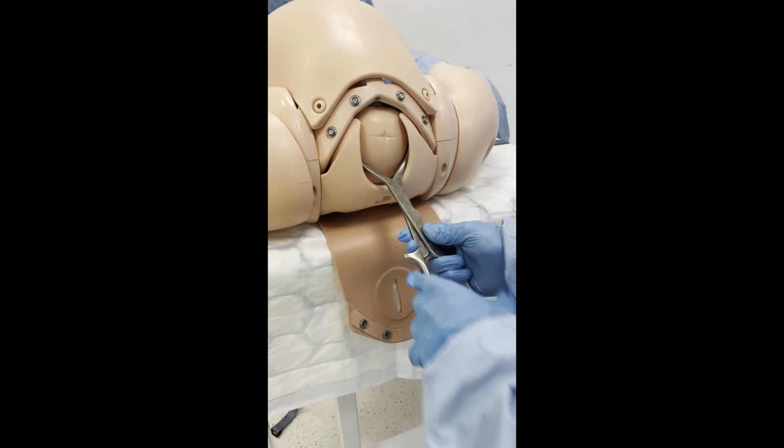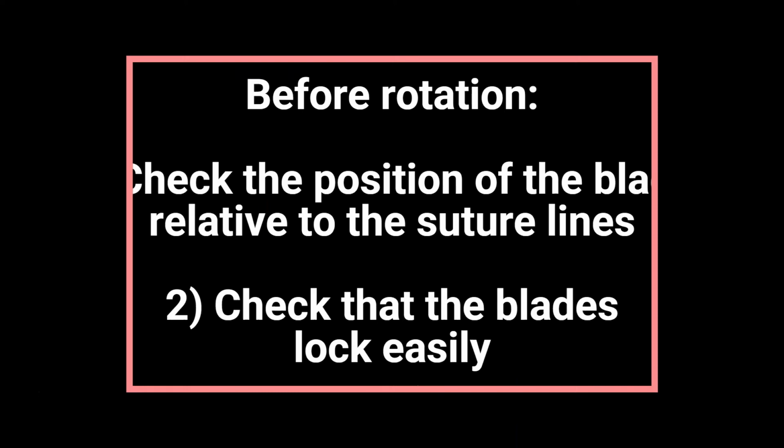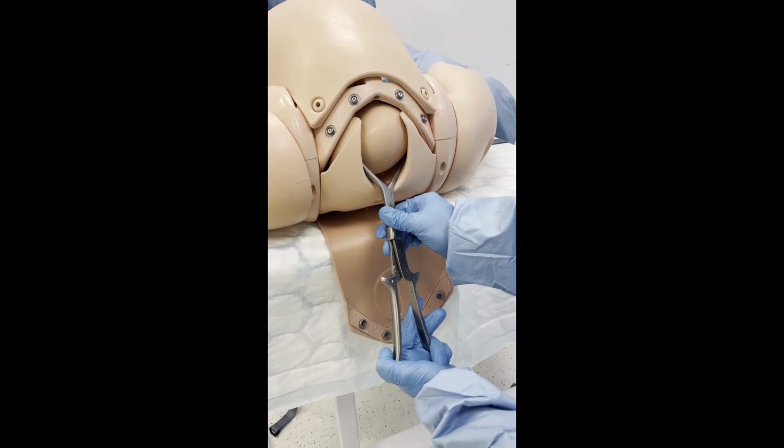After both blades have been applied, their position relative to the suture lines is checked. The blades lock easily. Only rotate in between contractions. The handles are pushed towards the operating table and upwards to disimpact the fetal head. Rotation is performed with ease. Check fetal position again after rotation. The fetal head is now OA.